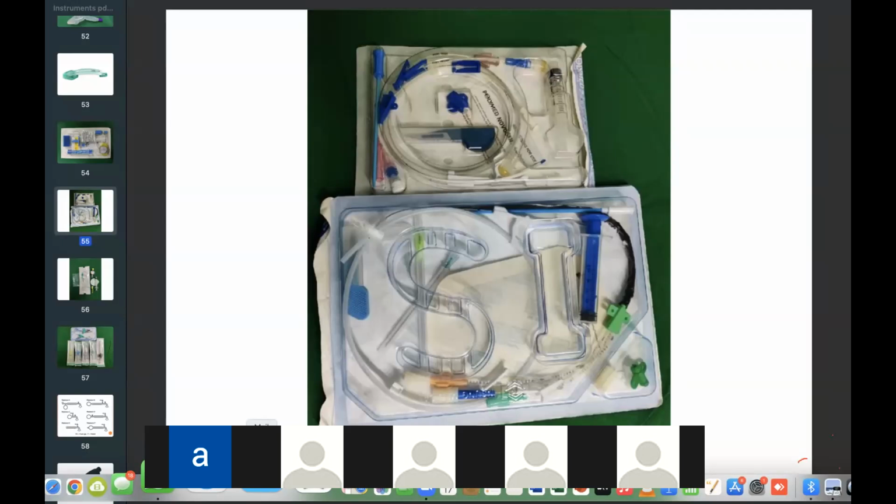What else? Ma'am, we can put Doppler and see for the color. That's perfect. But just like that, when you have just put in, which will be spherical, which will be oval? Ma'am, the arteries will show spherical, and there will be pulsations. The artery is spherical, and the oval will be the vein.